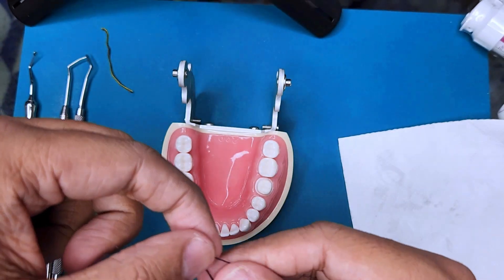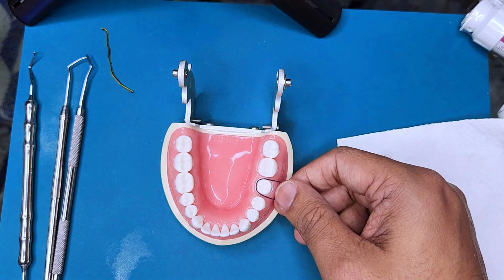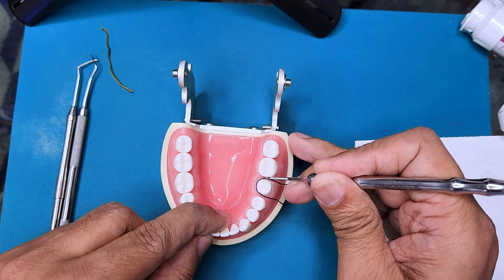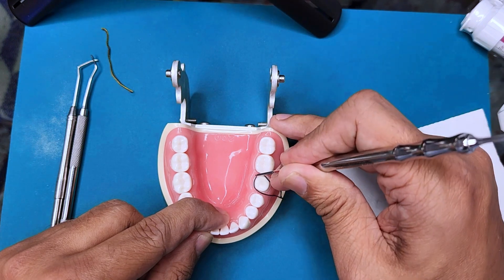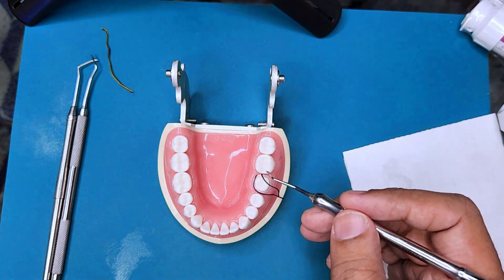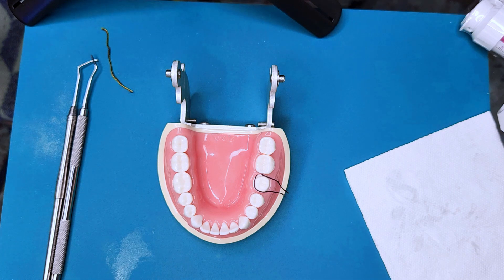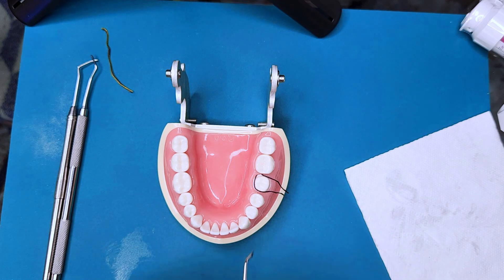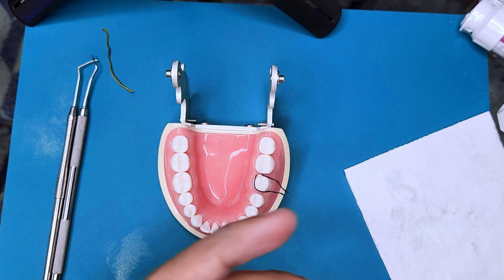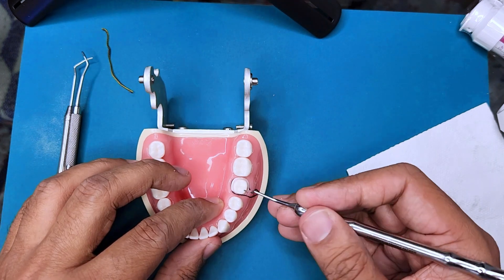For cord packing, it's best to make a loop around the tooth, held by the lingual or palatal side of the tooth. The first area to pack is the interproximal area, because that's the easiest for the cord to go in and stay. Once the initial part of the cord is inside, the whole process becomes easier. Start from one end, slowly pack the cord all the way around, and cut any excess.